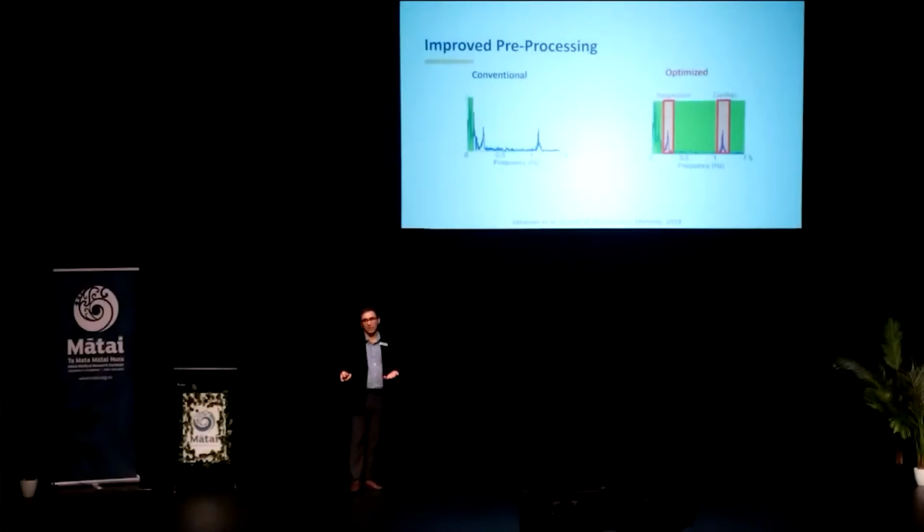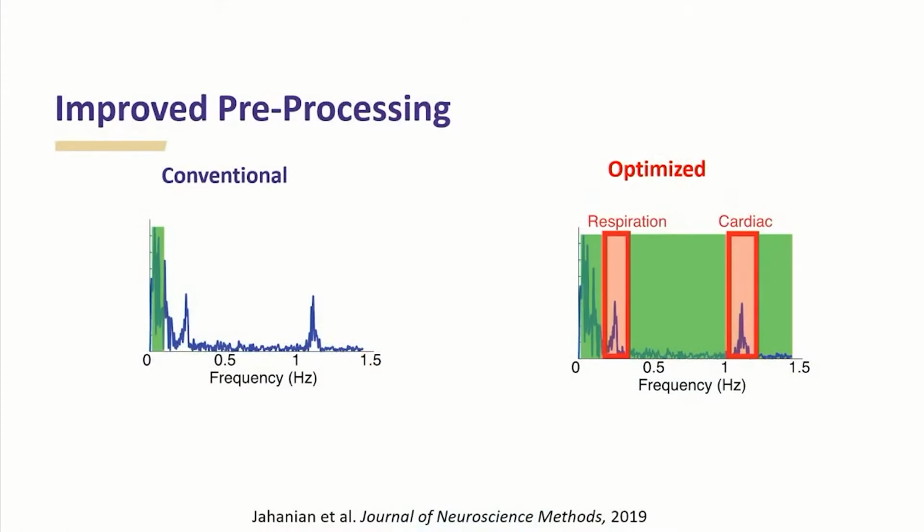So first of all, it gives us a lot of samples, so by itself, it improves the quality of the images, but it also has some other advantages, particularly in terms of improving the way that we are denoising the data. Because fMRI data is a very noisy data.